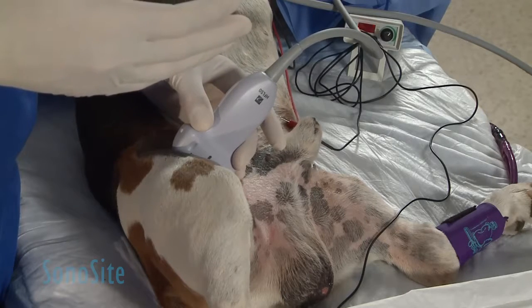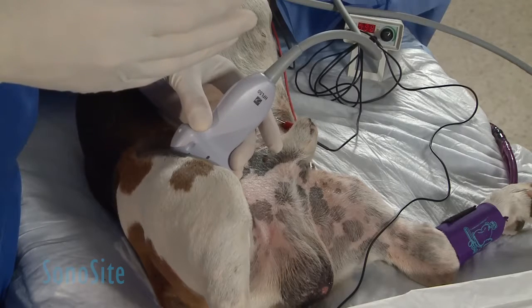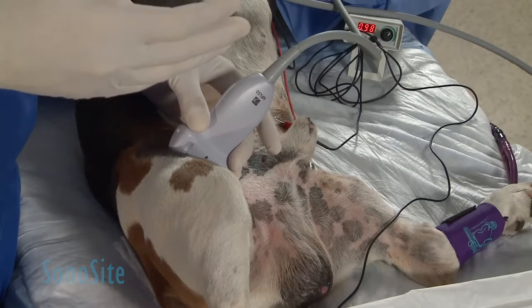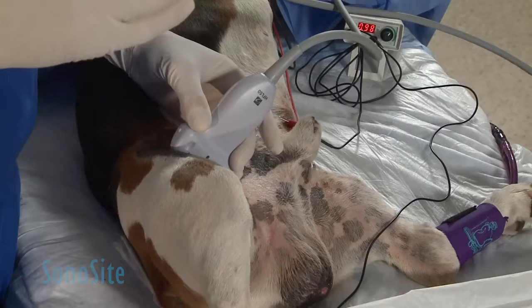If you look at the hyperechoic tail that I'm creating on this femoral artery, you'll see that just under that you have a hyperechoic structure that looks like a honeycomb — and that's our femoral nerve.